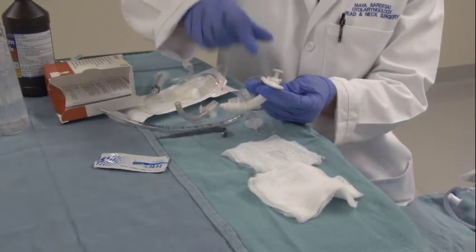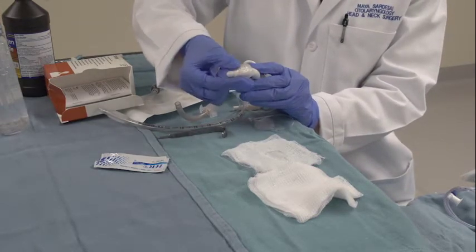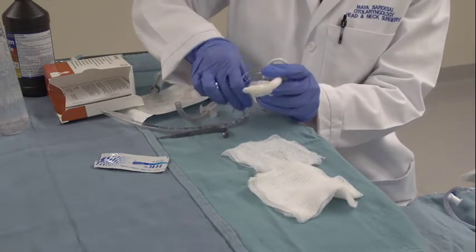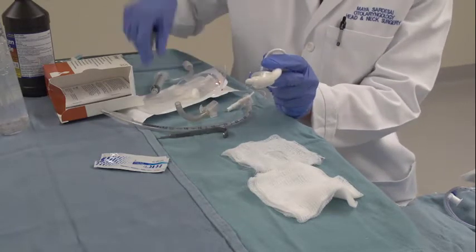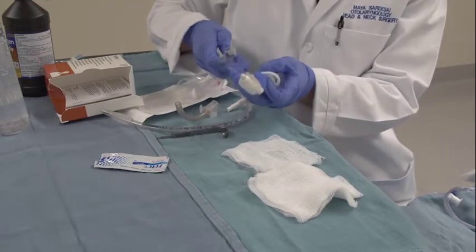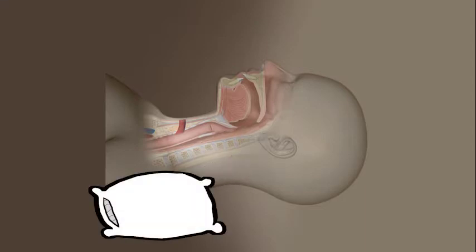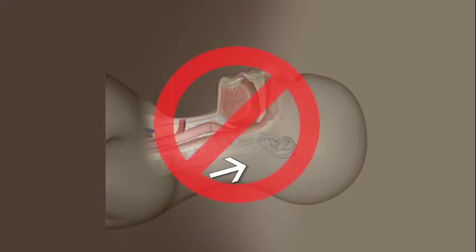You should replace the tracheotomy tube with the spare tube from your emergency supply. First, check the integrity of the cuff by inflating the cuff and checking for leaks. You will then deflate the cuff and position the patient for reinsertion. The best position to reinsert is for the patient to be flat with their neck hyperextended. You may place a blanket or pillow under their shoulders to help with this. Don't overextend the neck if the patient has a confirmed or suspected injury to the upper spine.